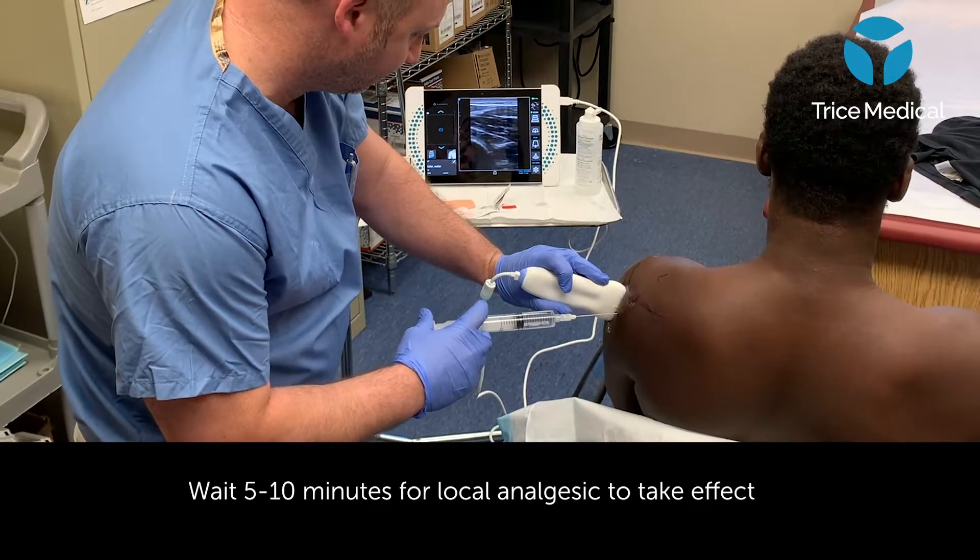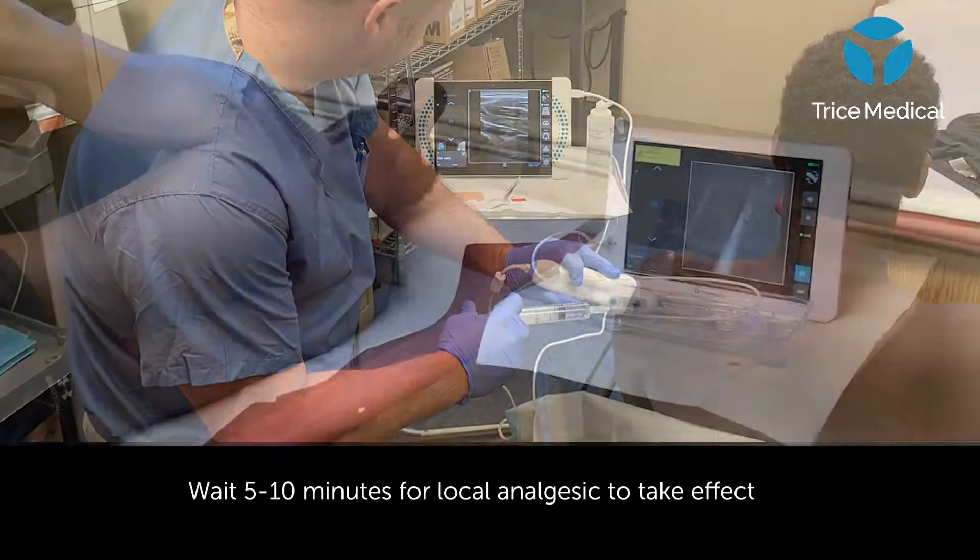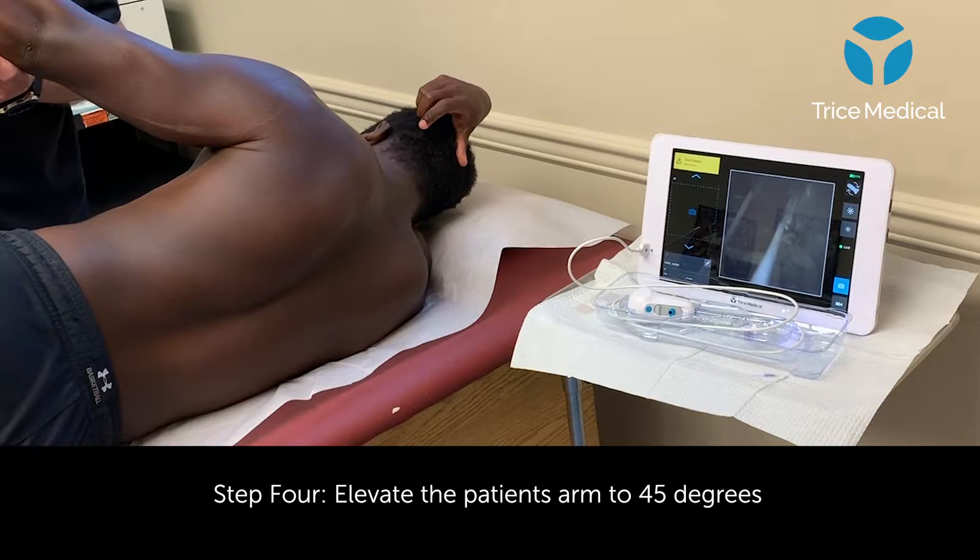Once complete, I'll let the patient become anesthetized for a period of 5 to 10 minutes and then come back and position them in the lateral decubitus position.